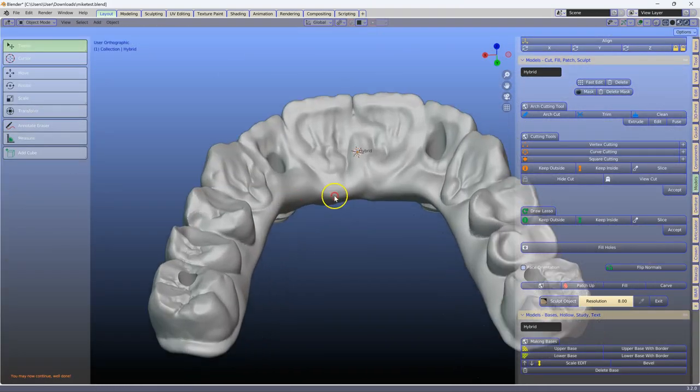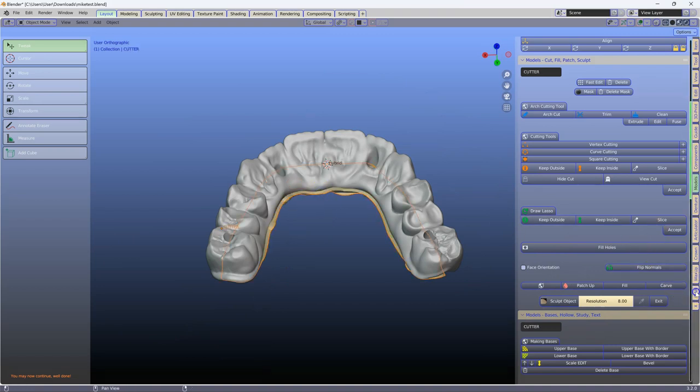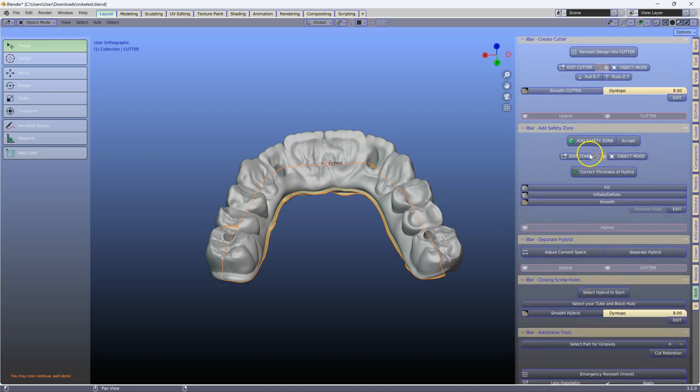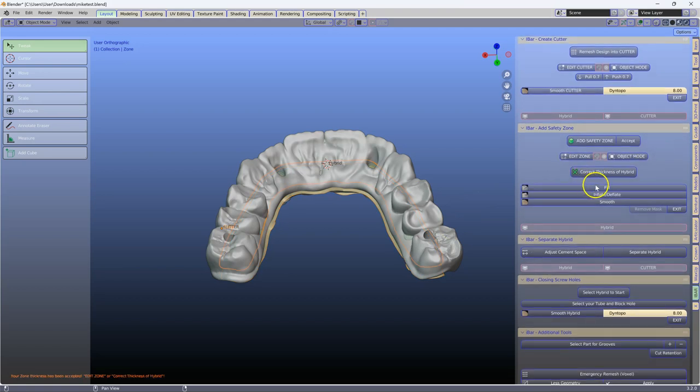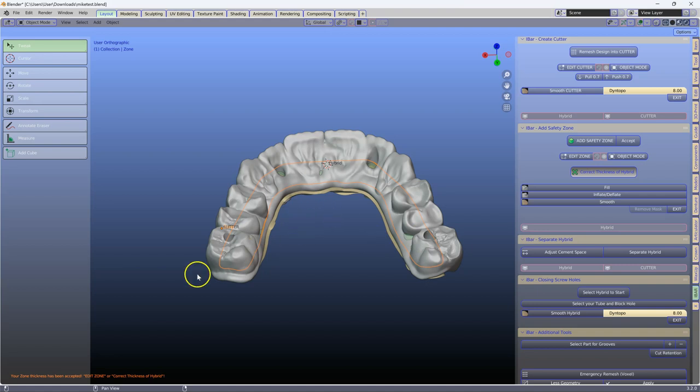Now, I'm going to expose my cutter one more time. We're going to go to the i-bar module, add a safety zone. Then, we're going to accept the safety zone, and we're going to correct the thickness. So here, we've got to correct there, a little bit over here, and this is going to be added to your hybrid.